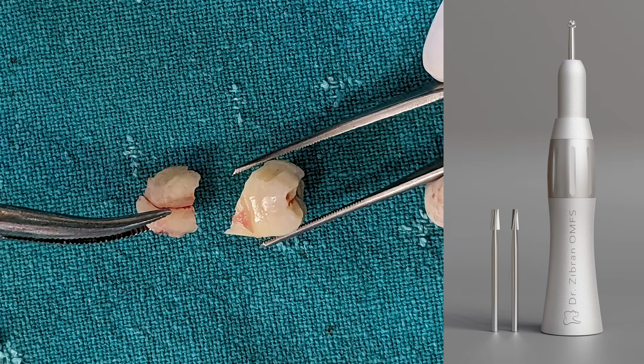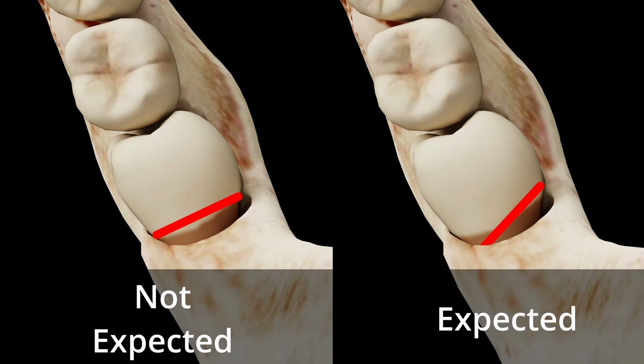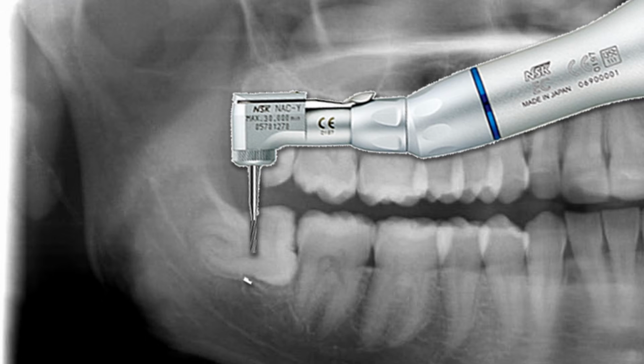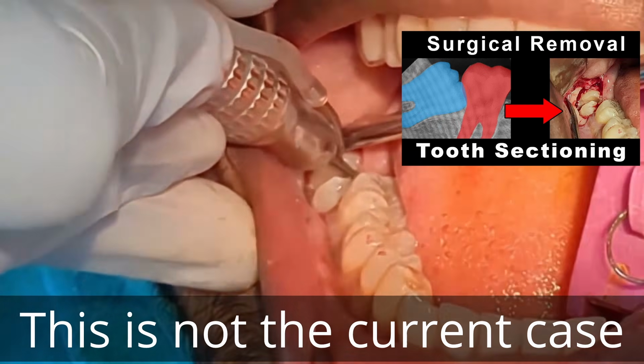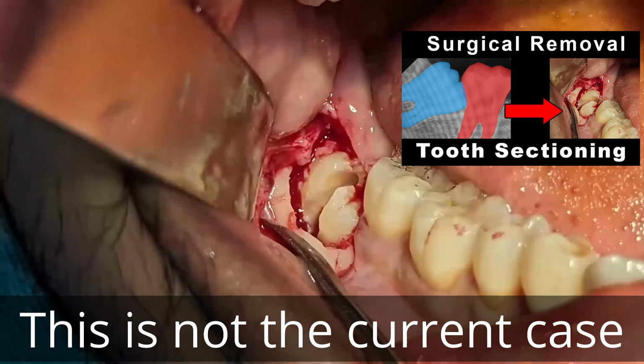Now this technique is quite difficult to execute with a straight surgical handpiece. Also, I never expect the cut that I place on the tooth to be straight buccolingually with a straight handpiece. It is possible only when you use a contra-angle handpiece. Many oral surgeons prefer hemisection of the tooth because it is easier to do with a straight handpiece. It is their preference and I totally support it. When there is no other option, I do perform hemisection. You can watch this video for that.